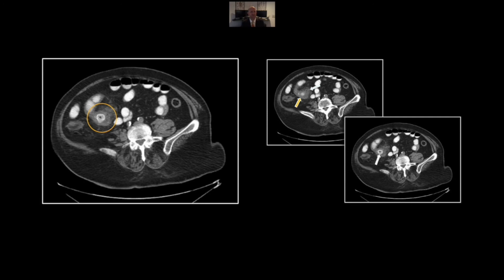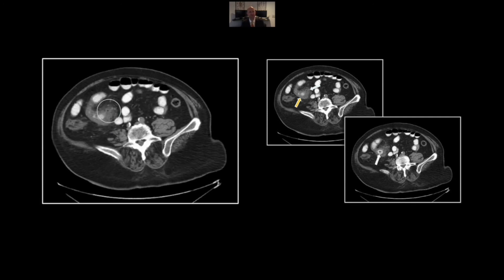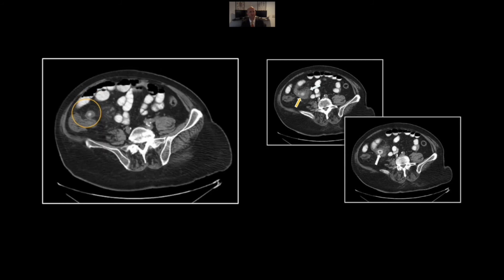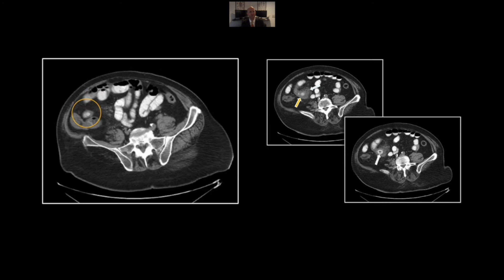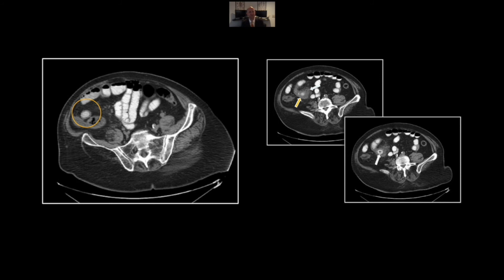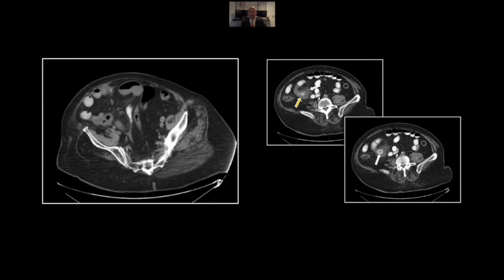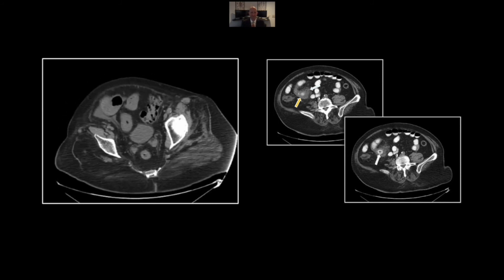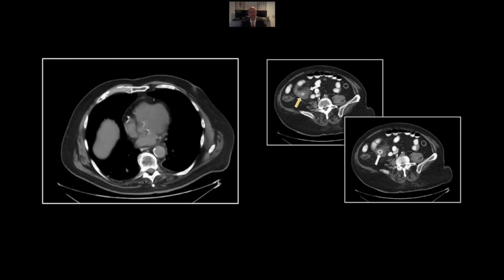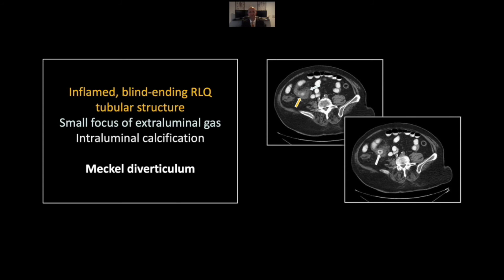There is the gas, the calcification, the stranding. Note the small bowel heading off in both directions, which enables you to say this is not in fact an appendix. That is a Meckel diverticulum with perforation.